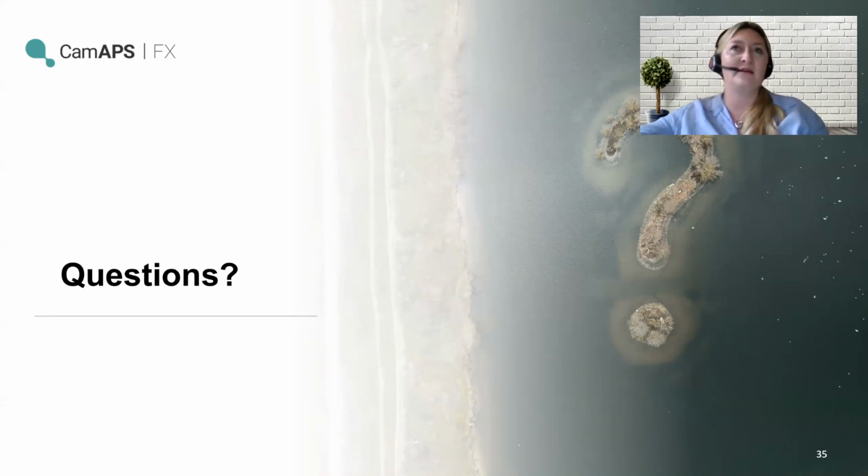If the system's aiming for quite a low target, it doesn't give you much room if it's a little bit too aggressive and you end up overshooting, which then often causes a rebound back up high again. That normally sets off that whole cascade of, oh gosh, I've gone a bit high, let's put boost on or give an additional correction. Often just upping that target a little bit can help smooth everything out, so it's not necessarily to the detriment of time in range on the whole.